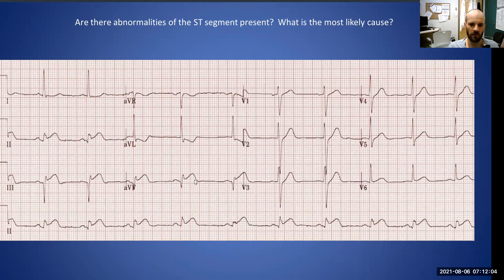I think it's a good guess with the timing because we don't have any T wave inversion here. So yep, that's possible. It could be less than 12 hours, or it could be that there's some persistent ST elevation because this is something that's really, really old, and there's an aneurysm in those areas. There's only so much you can get from an ECG. But you're absolutely right. We've got the ST elevation here, and it's not in V1 to V3. This is an inferior MI pattern. Very good. Full marks.